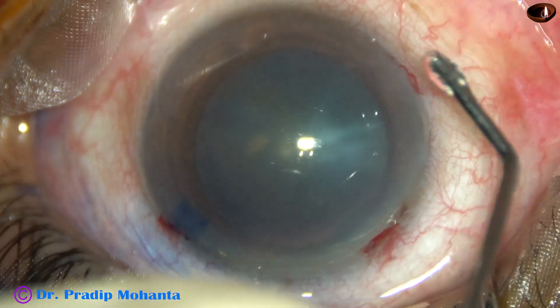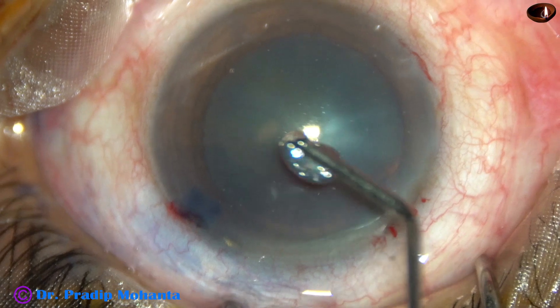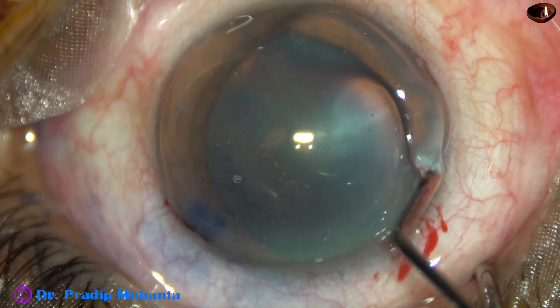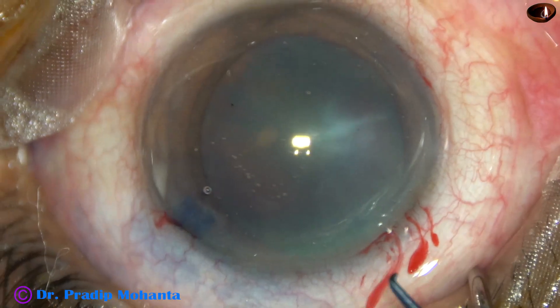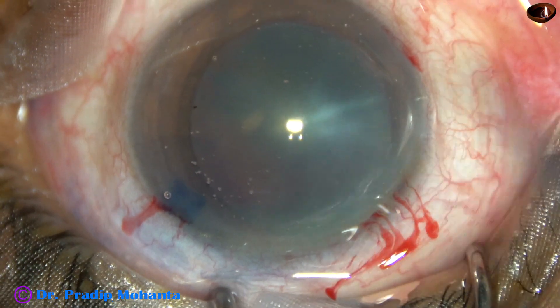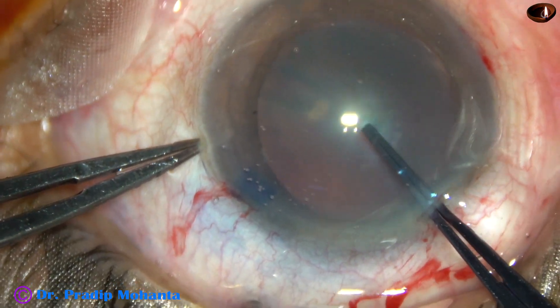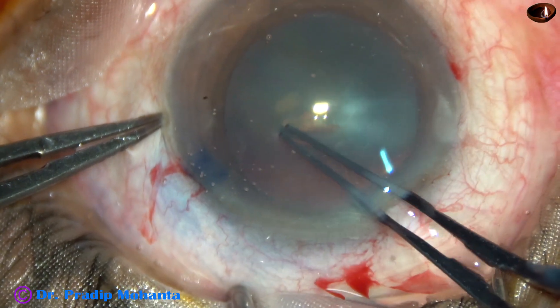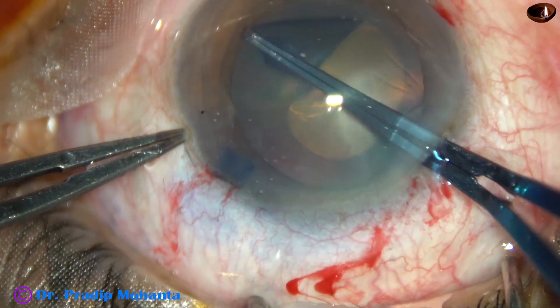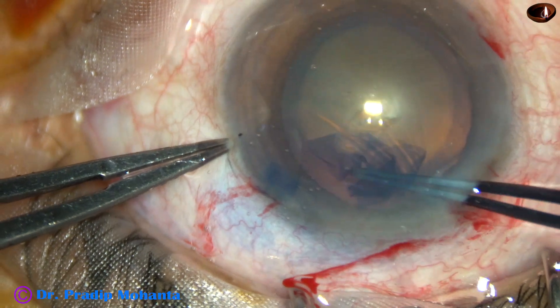2% hydroxypropyl methyl cellulose is used to fill the anterior chamber, and it is also applied over the corneal epithelium for better visibility and for protection of the epithelial cells. A utrata forceps is used to do capsulorrhexis. The utrata forceps goes in and the tip makes a puncture on the anterior capsule, raising a capsular tag. The capsular tag is held and moved anticlockwise, remaining at a certain distance away from the margin of the dilated pupil.